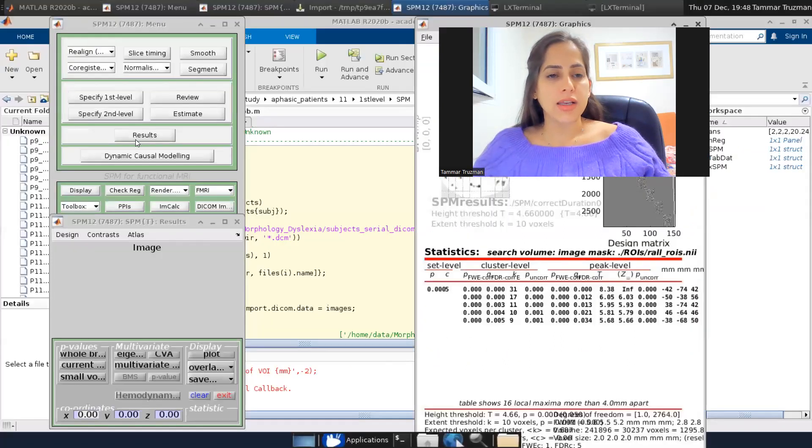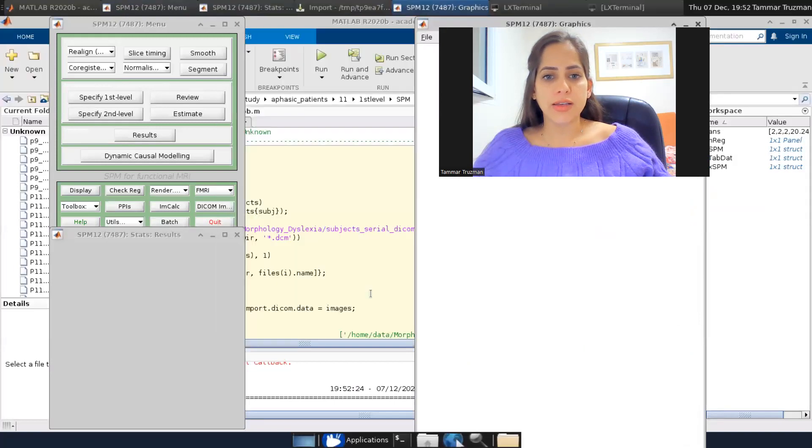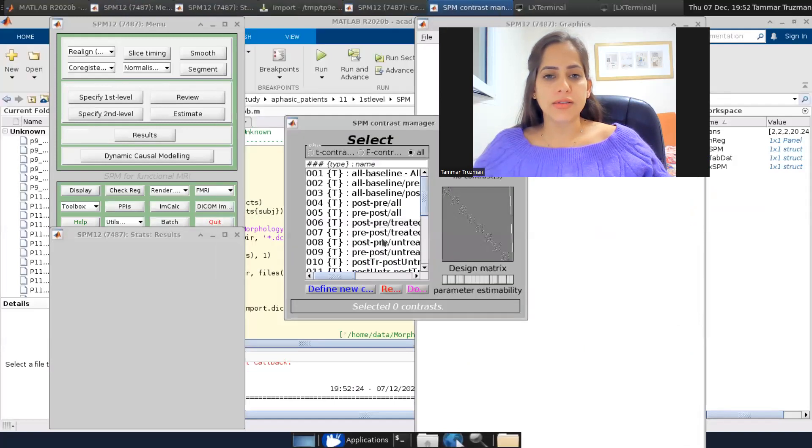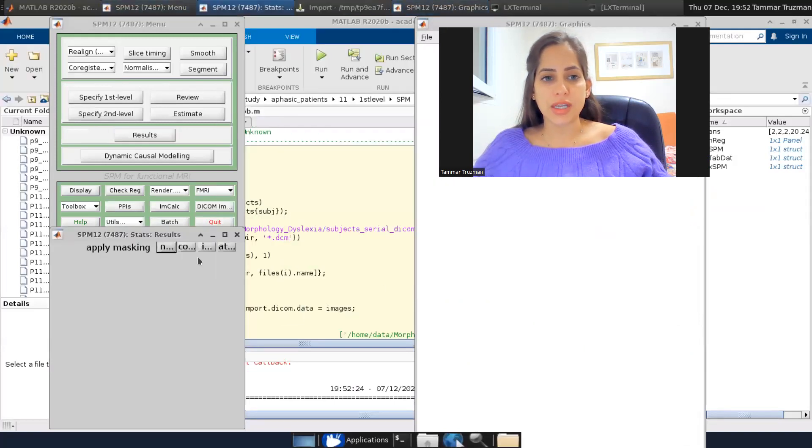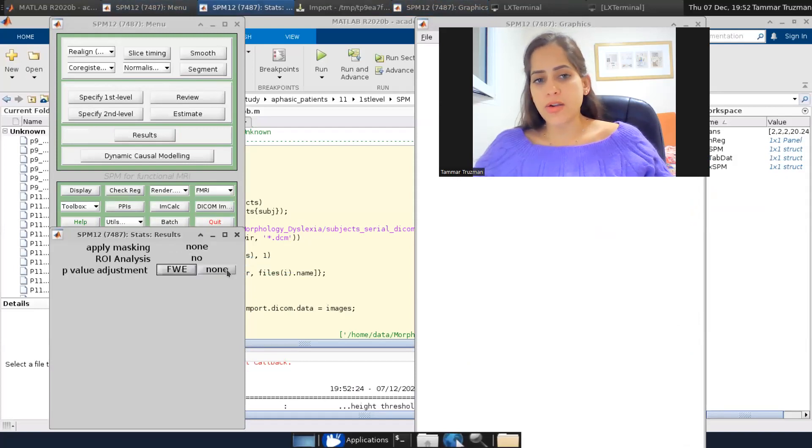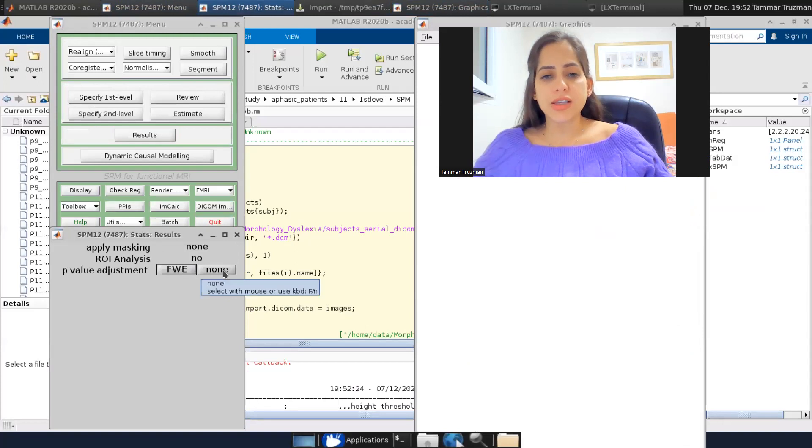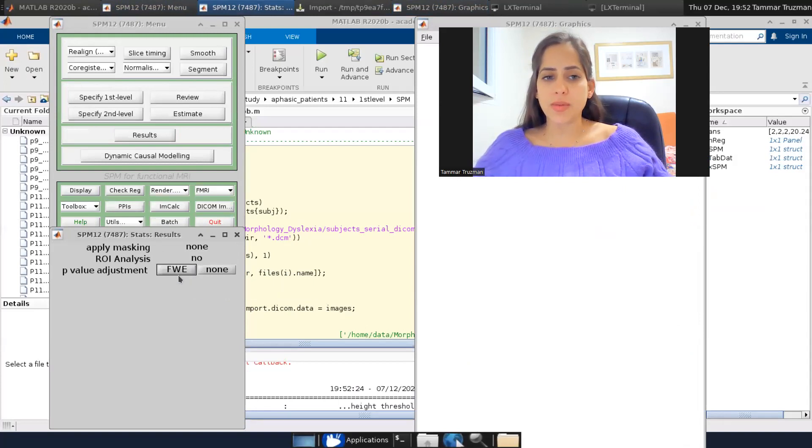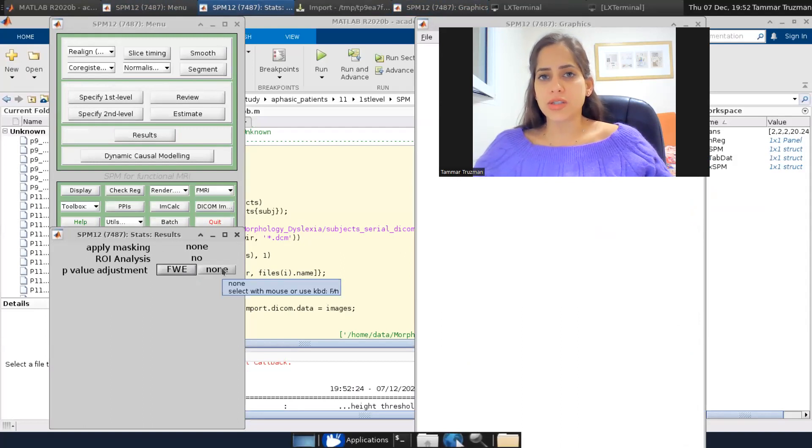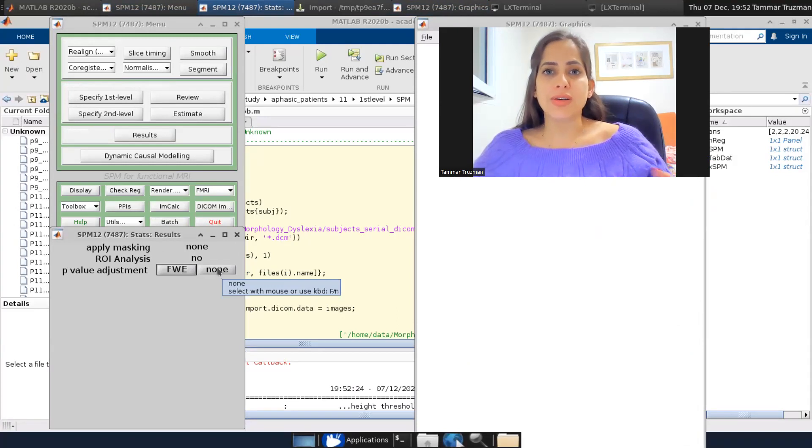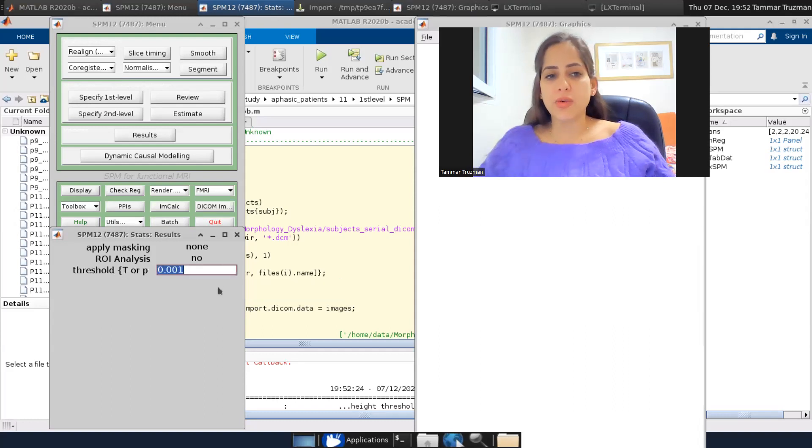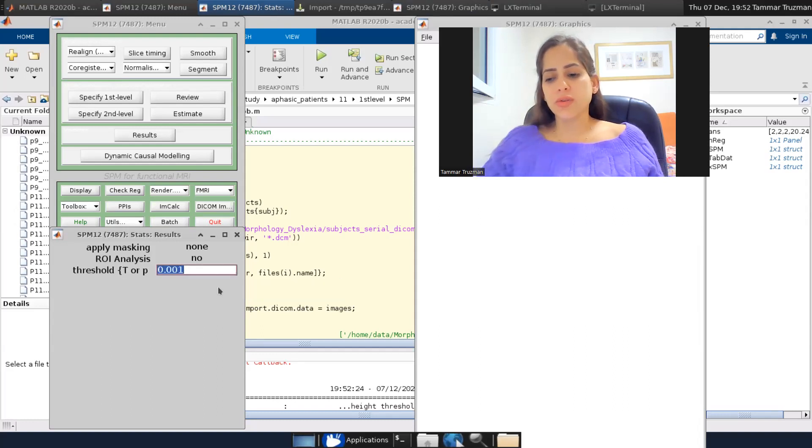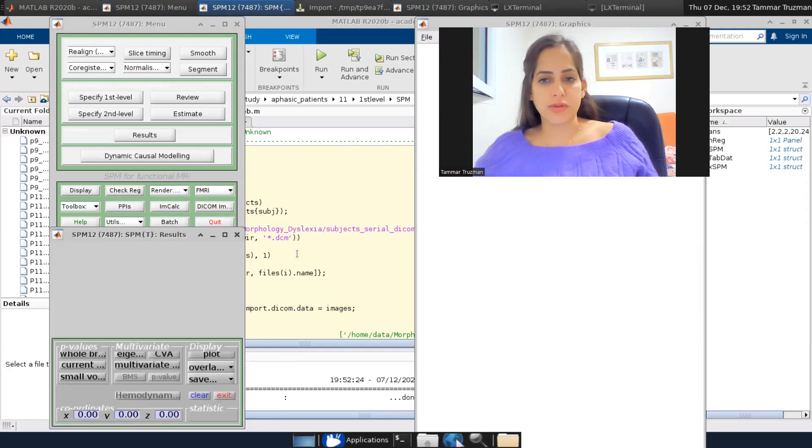So let's go to the SPM and show this. I load my SPM.mat file and the specific contrast I'm interested in. At this stage, I'm not applying any masking. It's not an ROI analysis as we said before. At this stage, for our purpose, it doesn't really matter if we use family-wise or uncorrected p. I'll go with the uncorrected just so we could see the differences when I later correct for multiple comparisons only for the VOI. So actually the small volume correction. So I go with 0.001 and use an extent threshold of 10 voxels.